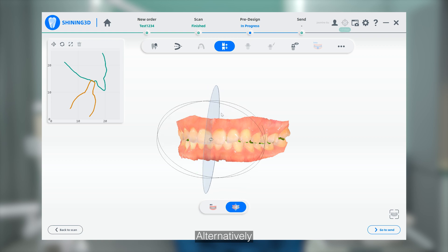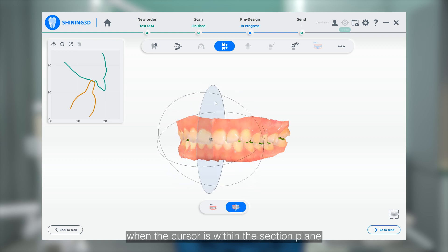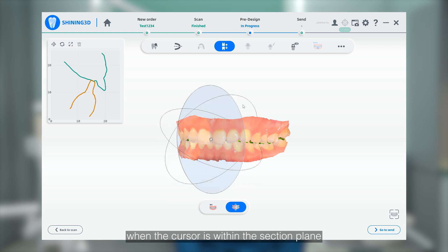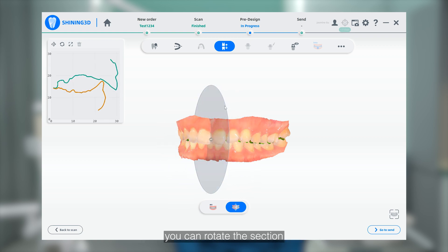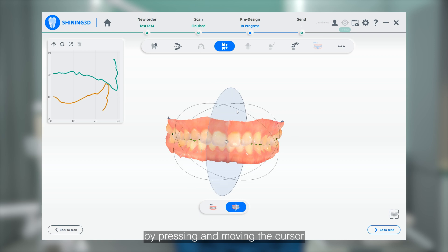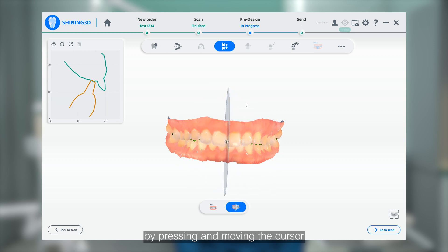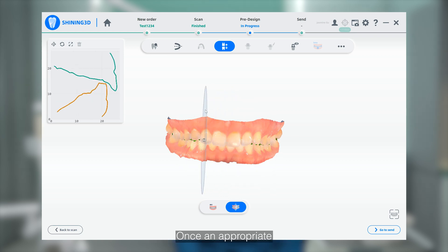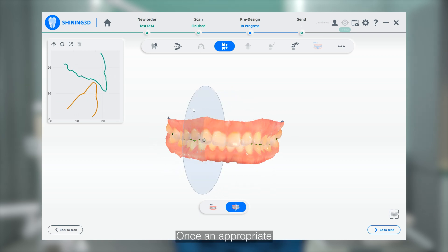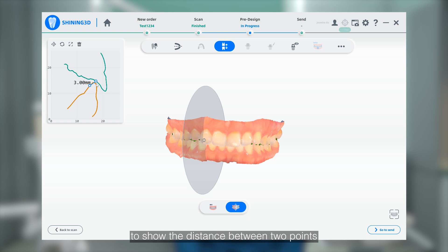Alternatively, when the cursor is within the section plane, you can rotate the section by pressing and moving the cursor. Once the appropriate section plane is captured, you can click on points in the 2D view to show the distance between two points, facilitating the observation of the occlusion situation.